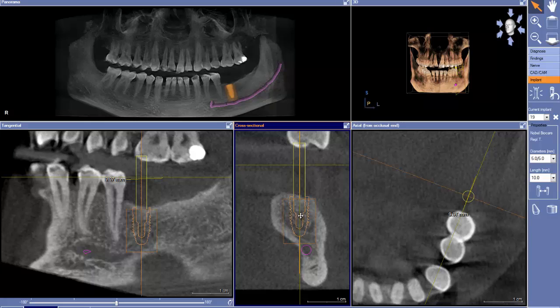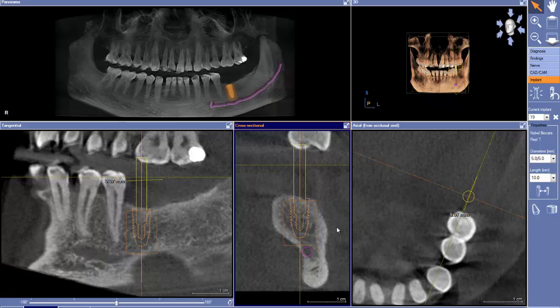Maybe placing the implant about right there. I would be very comfortable personally going to a 10 millimeter implant in this particular case. So I think your plan, generally speaking, is good. I would definitely move that implant over to the mesial, closer in approximation to tooth number 20, and then go from there.